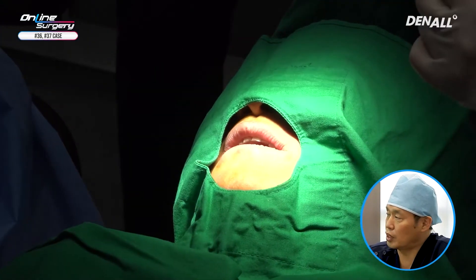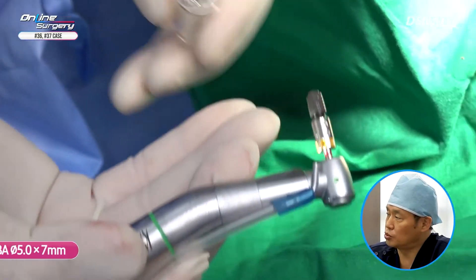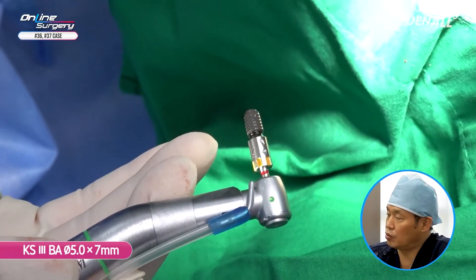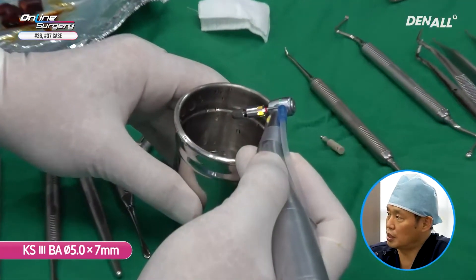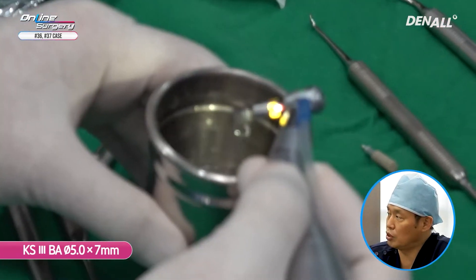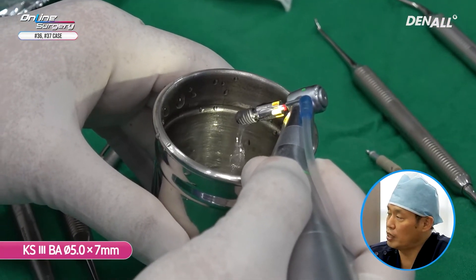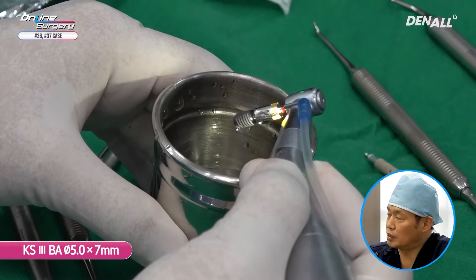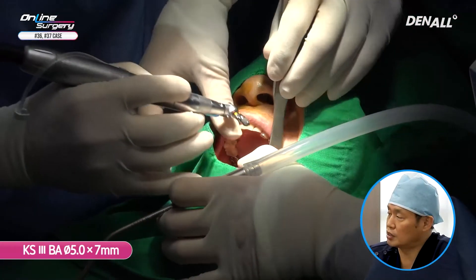KS3 BA surface 5.0 by 7 mm implant is used. This is a hydrophilic surface, therefore you need to irrigate it sufficiently using saline before you place the implant.